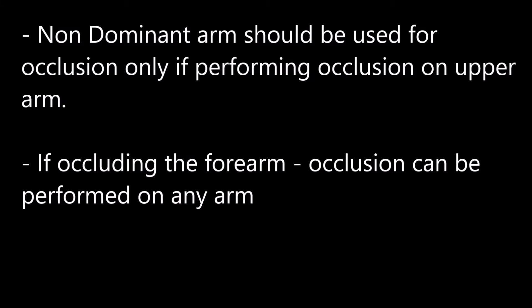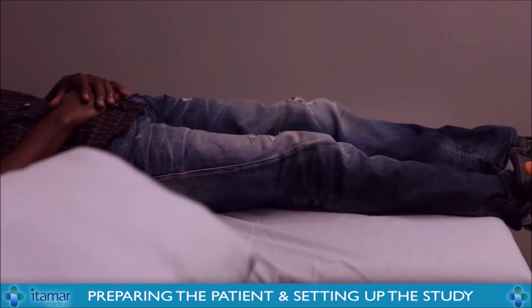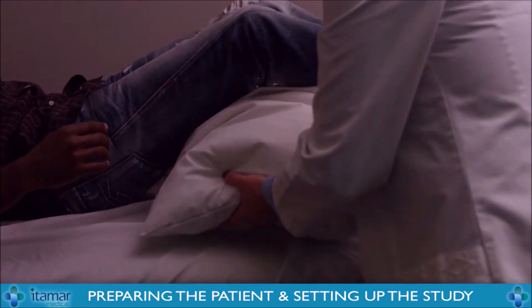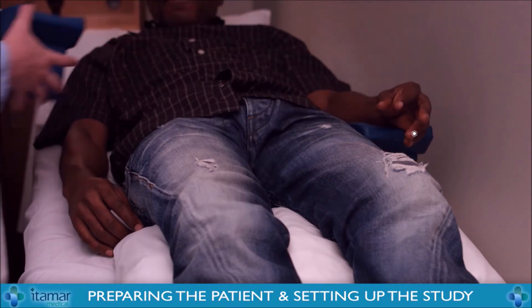Do you have any questions before we get started? No. Why don't you go ahead and lie down now? Let's put a pillow under your knees so you can be more comfortable. Let's go ahead and put this hand rest, one on each side, and lay your arm there.